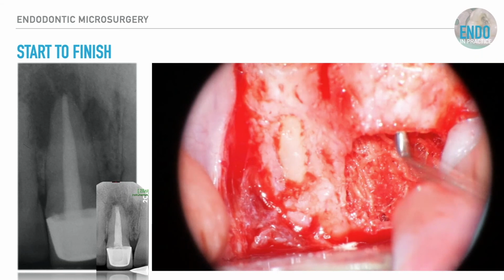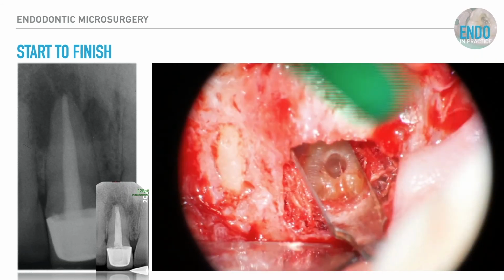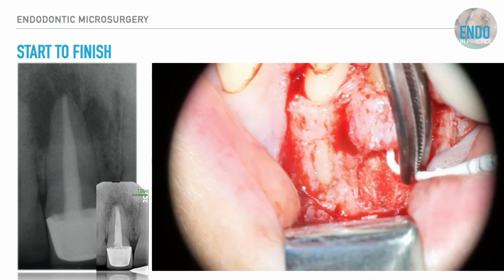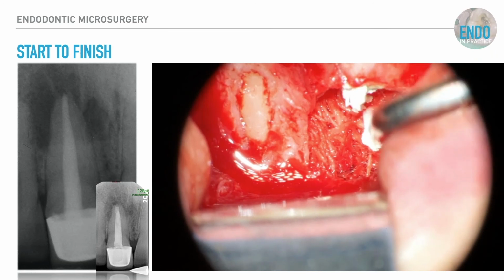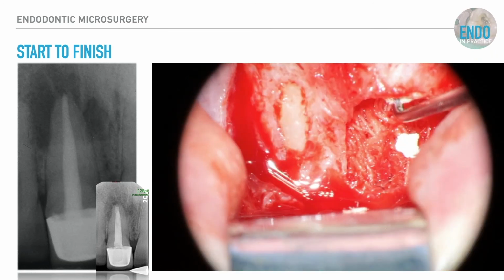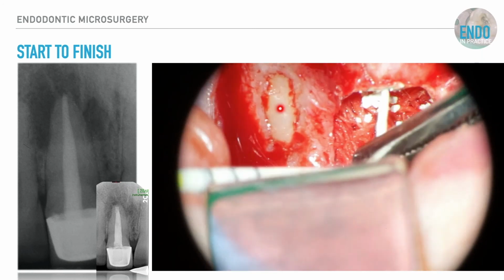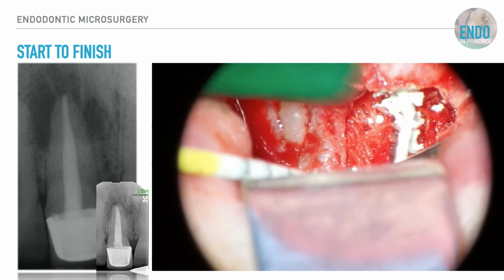I used 3 different layers of gauze, just 3 different slices of it, with local adrenaline-containing local anesthetic. Little tiny amalgam plugger. Dry it up with some sterile paper points. And then ready to receive the MTA. The worrying thing actually for me was over here, can you see the fenestration on the adjacent root surface? The gauze catches the MTA nicely, and then you can lift it out and you get some good hemostasis.